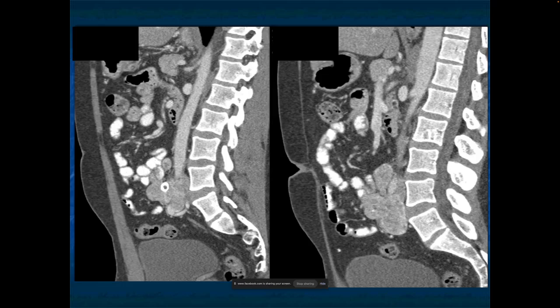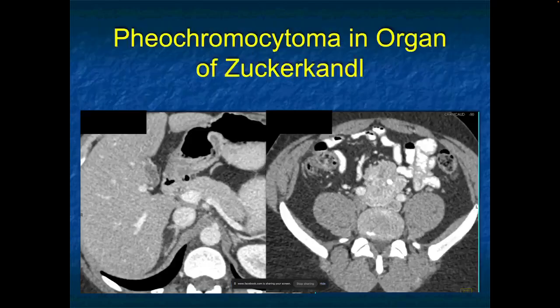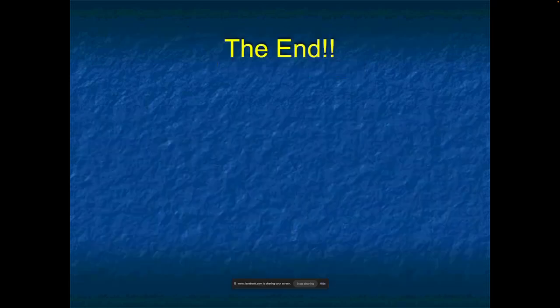And you can see, look how it encased the vessel, but with chemotherapy, and then potentially people have done that, but typically resection, which can be a challenge, particularly if the lesion is infiltrating. So pheo at the organ of Zuckerkandl, that's Zuckerkandl, not Zuckerberg like in Facebook. Again, classic location, organ of Zuckerkandl.